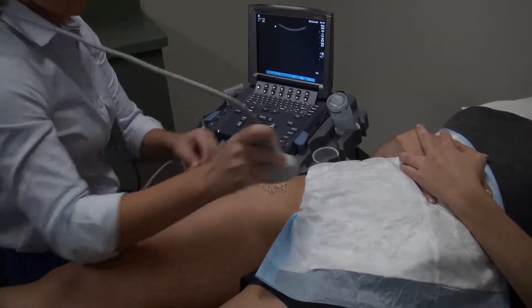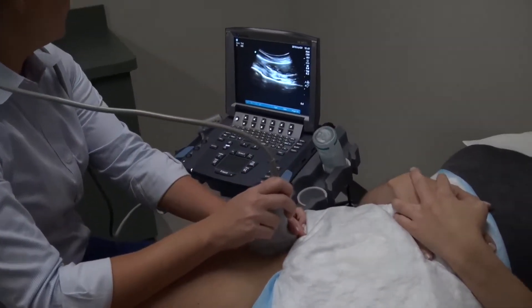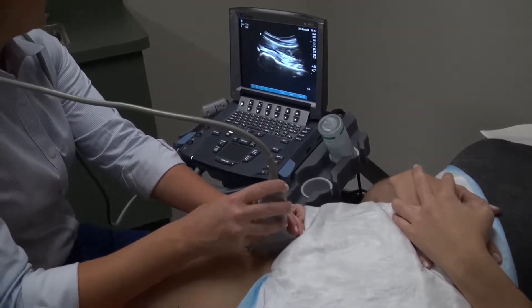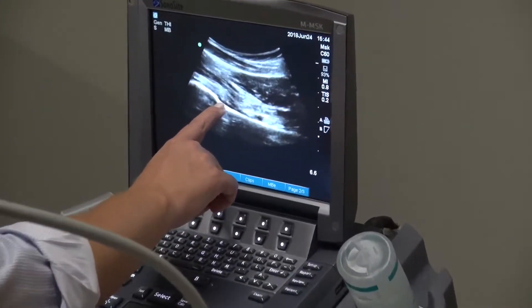The transducer is placed in long axis with the femoral neck, allowing visualization of the anterior rim of the acetabulum, femoral head, femoral neck, and joint capsule. The goal of the intra-articular hip injection is to enter the joint capsule at the anterior lateral surface of the femoral neck at the femoral head-neck junction.